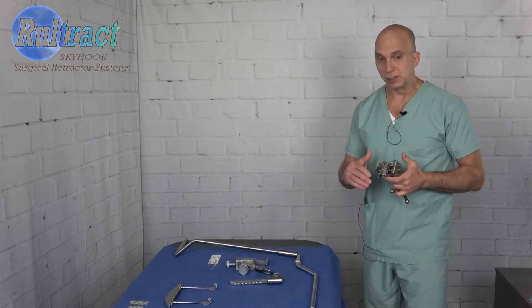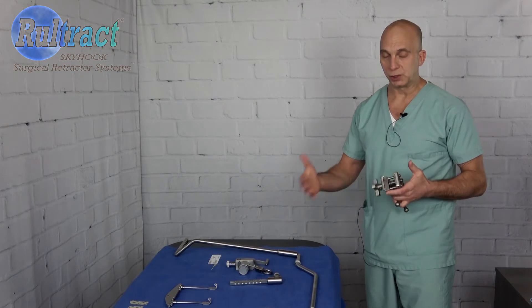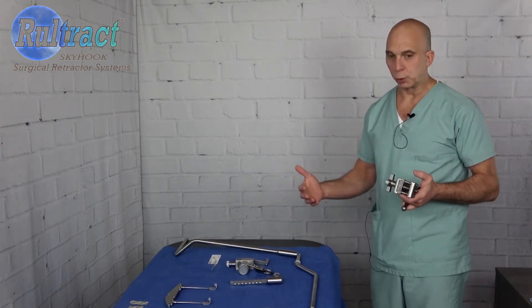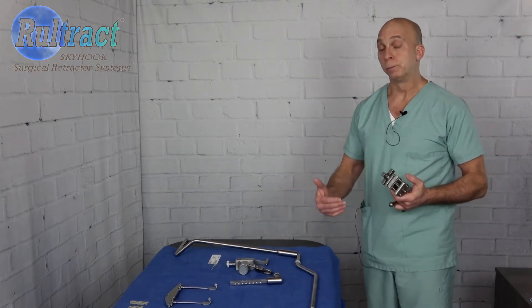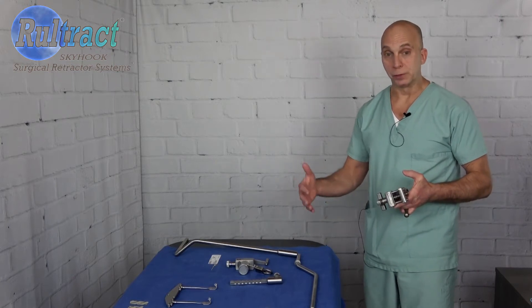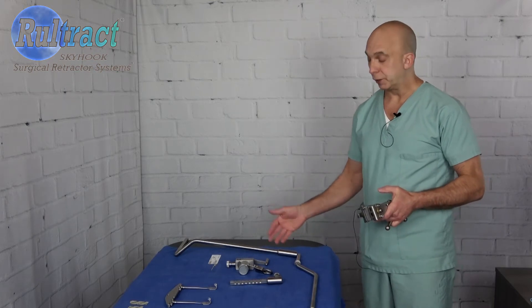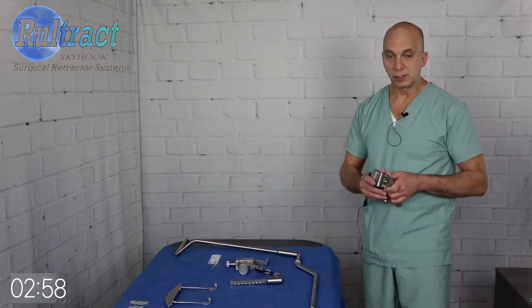We did decide to send a whole set. What I would suggest is to have sterile processing label this as the Rultract obese patient set or something along those lines. So when you have a large patient on your schedule you can call for this particular tray — the Rultract obese set. When you do get that tray you'll have everything that you need. So let's go ahead and set this up real quick.